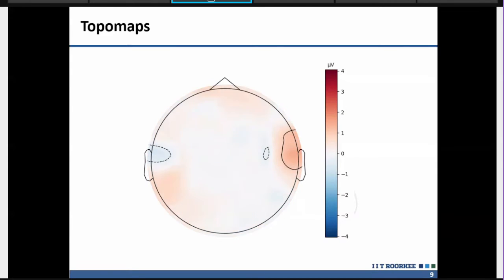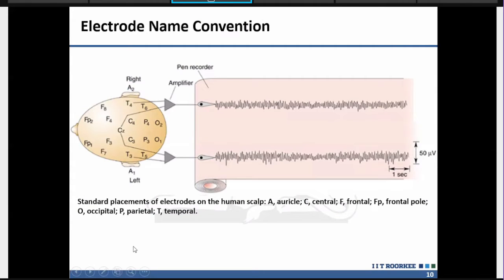So we'll discuss. Now, as I was saying, you have these sensors, and this device has different electrodes, which actually collect the signals. As in one of the videos you have seen, we collected the signals for blinking from F4. F4 is actually a standard name for these electrode positions. In the brain there are different parts: frontal, parietal, occipital, and these electrodes are also named accordingly.